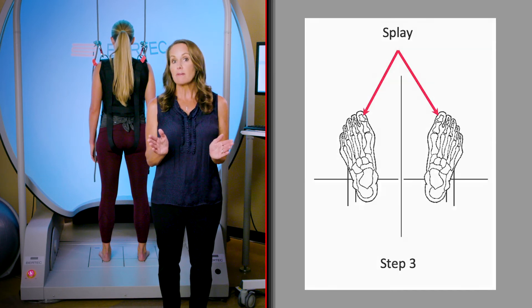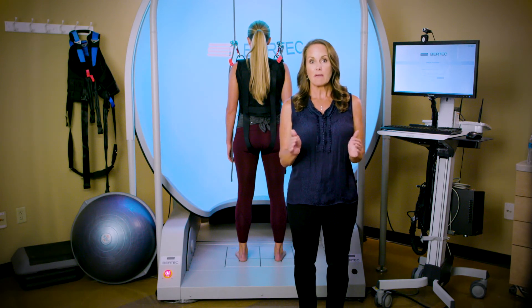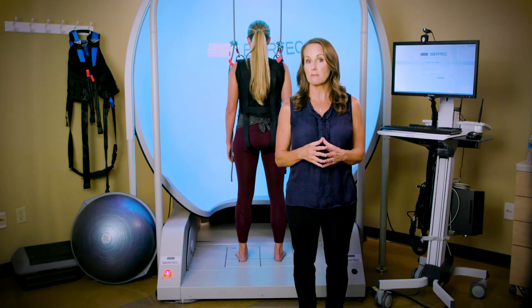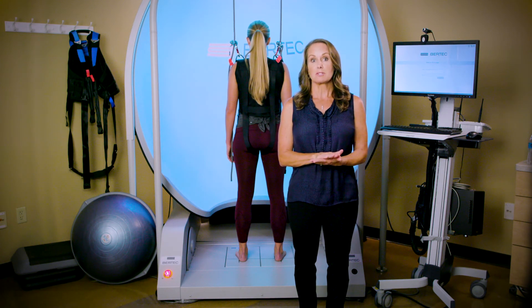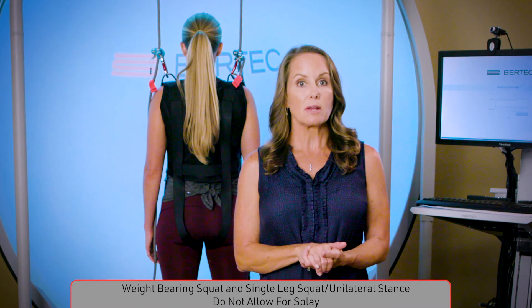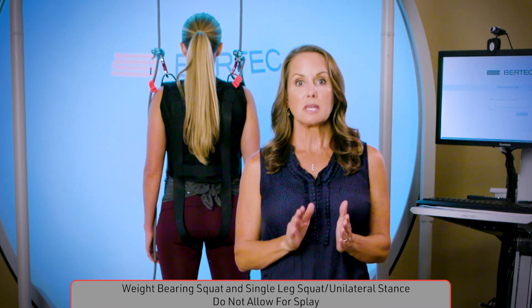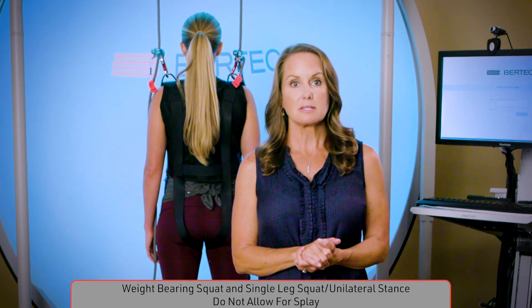Some patients are more comfortable with their toes going in slightly — you can have them move their toes in and get into a comfortable position for testing. However, a few assessments do not allow for foot splay. The weight-bearing squat asks that the patient keep their toes pointed forward and not splay their feet. The single leg stance assessment also requires the foot to remain in a straight or neutral position when testing. We will go into further detail on stance positions when we review each assessment.